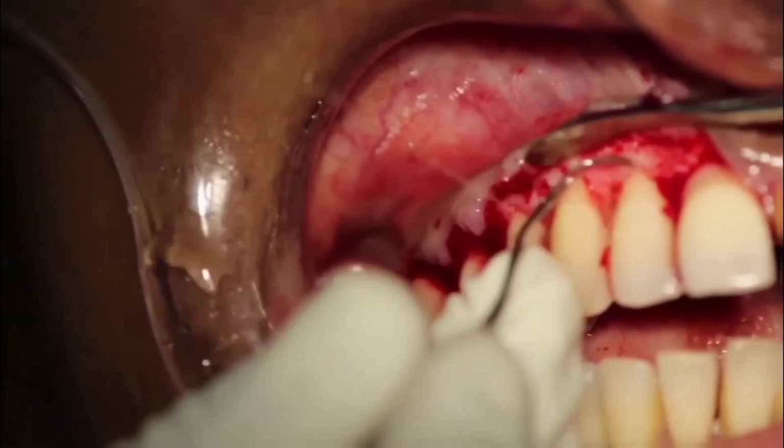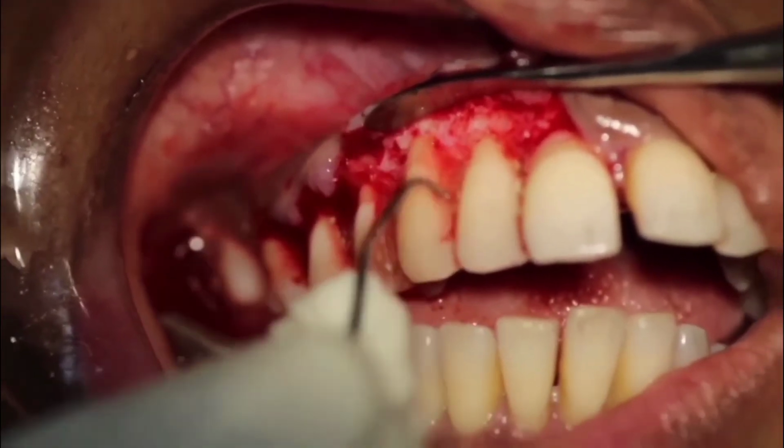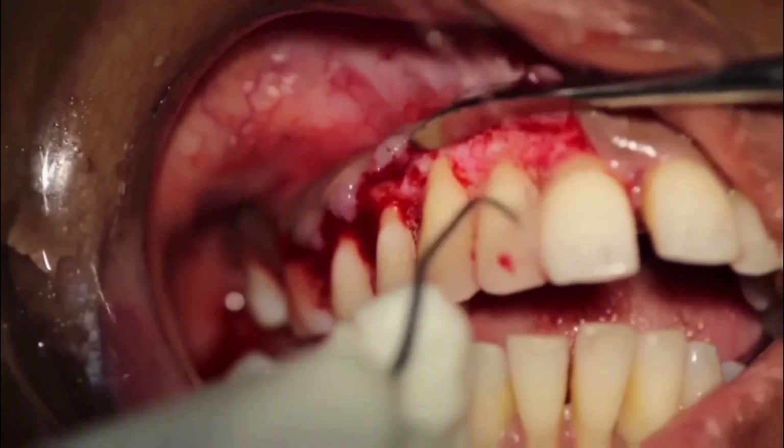A thorough debridement of the granulation tissue was done under continuous irrigation of saline by using curettes, and the residual calculus deposits were removed by using a scaler.